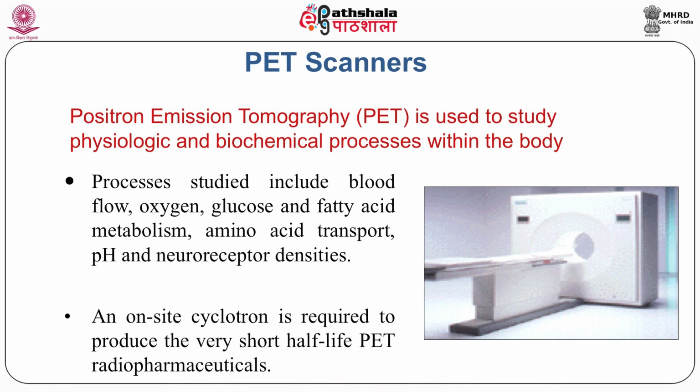And because these radionuclides which are used in PET scanners are produced from a cyclotron, we definitely need to have a cyclotron at our place, because of the short half-lives. But more than 90% of examinations you can do with fluorine-18. Sometimes, though, clinical examinations which are very typical in nature may require other kinds of radionuclides which are produced from a cyclotron and have short half-lives.